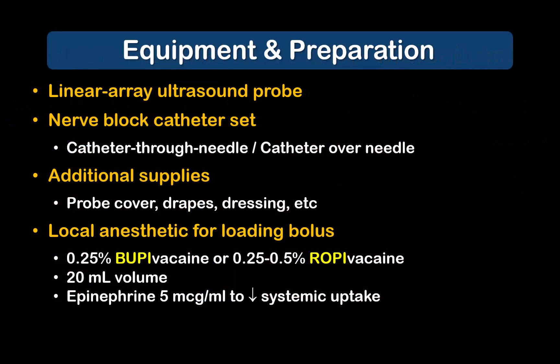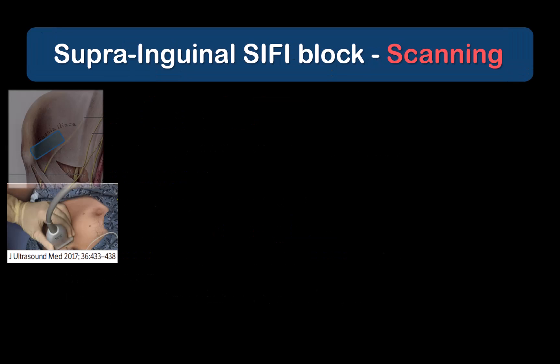Prepare the usual equipment and drugs needed for catheter insertion. Place the probe with its lateral edge on the ASIS and the medial edge pointing towards the umbilicus in an oblique orientation.